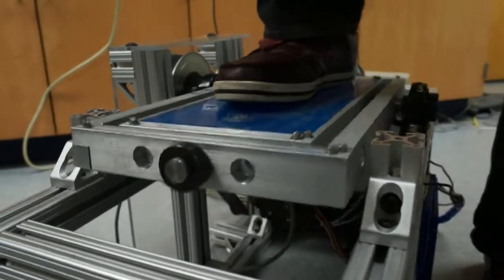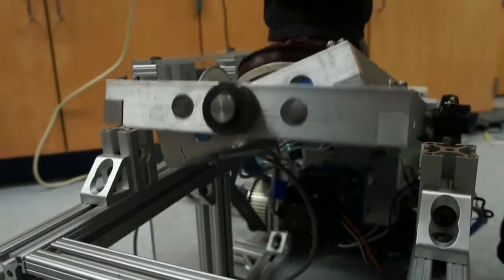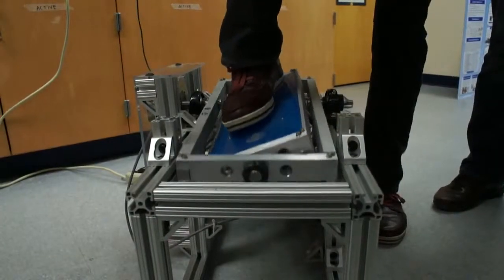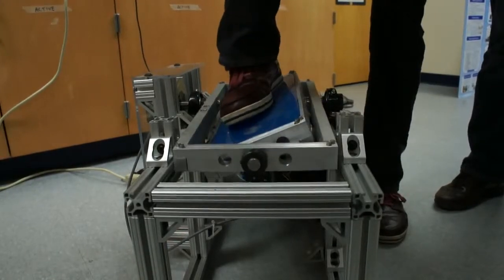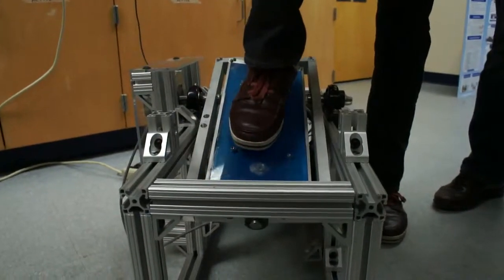This may be a first step in rehab training where you're just starting to trigger the muscle memory and fire all the nerves, so eventually they can start strengthening the muscles and retraining their ankle and one day be able to restore normal functioning.